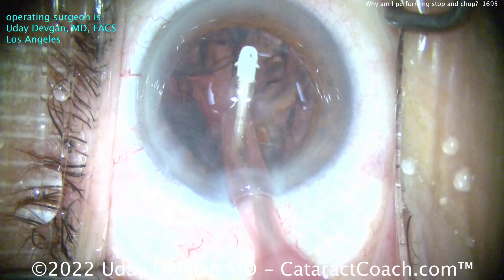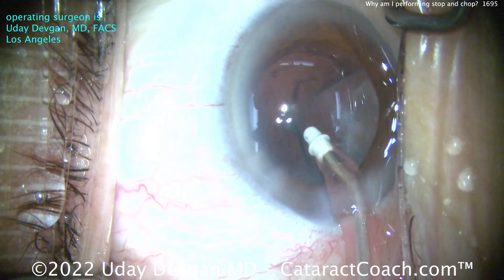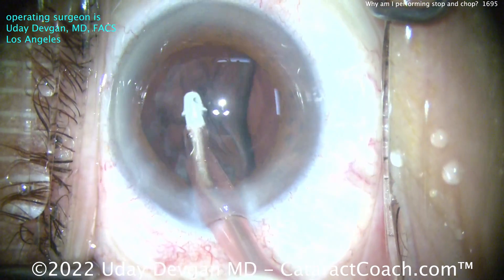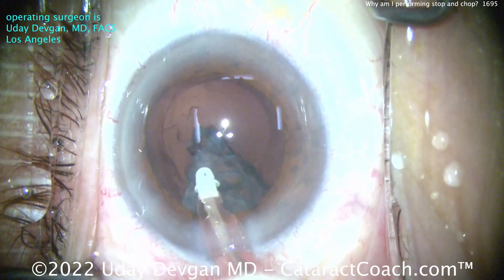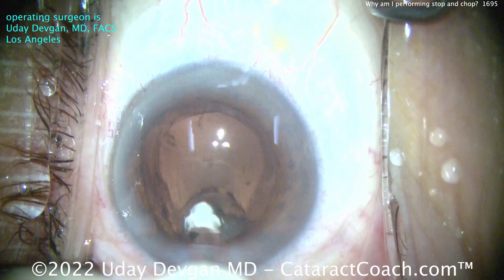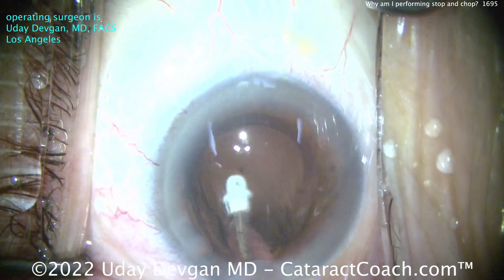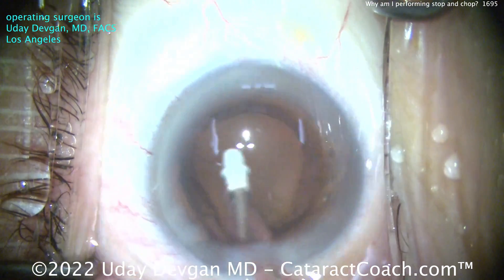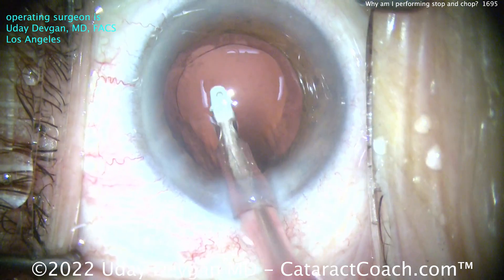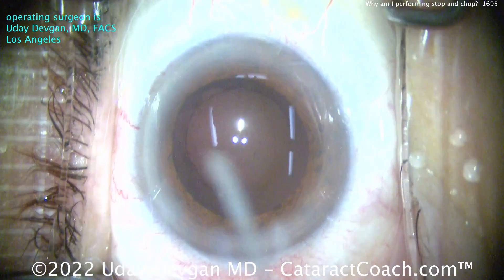I'm taking my time. Yes, it is true — I am a slower surgeon now, 22 years after my training, than I was five years after my training. Because I used to be naive; five years after my training I thought that speed meant a lot. It turns out, no. Beautiful surgery and perfection with a high degree of safety and precision — that means a lot. So I have actually slowed down my technique. Yeah, it's six or seven minutes for this case, but it's a beautiful outcome.